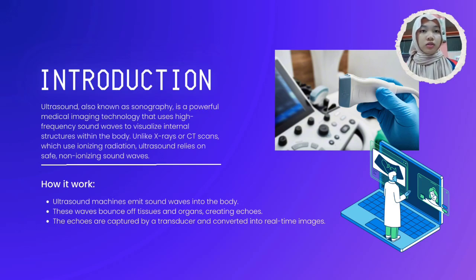Introduction of ultrasound. Ultrasound, also known as sonography, is a powerful medical imaging technology that uses high-frequency sound waves to visualize internal structures within the body. Unlike X-ray or CT scans, which use ionizing radiation, ultrasound relies on safe and non-ionizing sound waves. So, how does it work?